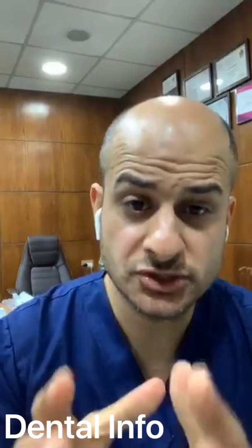What if we have two apexes for the same canal? How can we compact the apex by one vertical method? Very nice question, Dr. Rashid. Dr. Rashid here is asking about the delta.